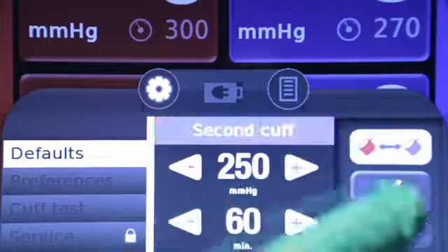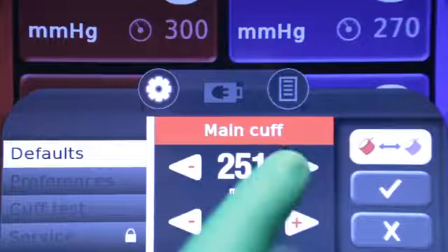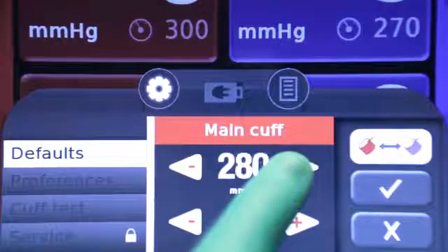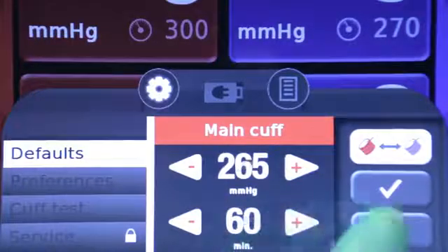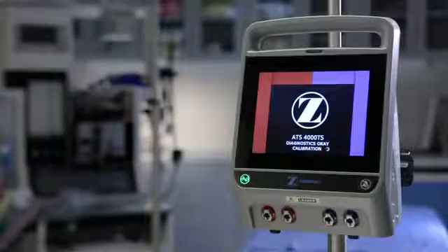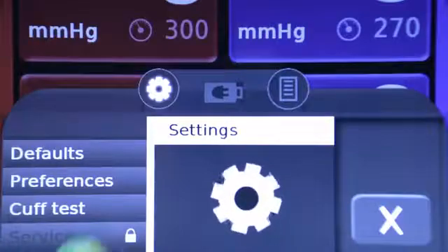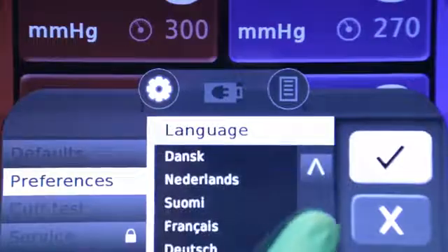Tap the cuff toggle button to switch between the main and second cuff. Tap the left arrow to decrease or the right arrow to increase the default pressure or time. Tap and hold either button to change the setting in 5-unit increments. Tap OK to save the indicated pressure or time as the new default setting. The new settings are stored in memory but will not take effect until the machine is restarted. The settings menu also allows changes to user preferences, including brightness, volume, and language.